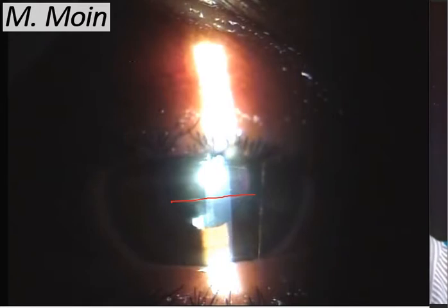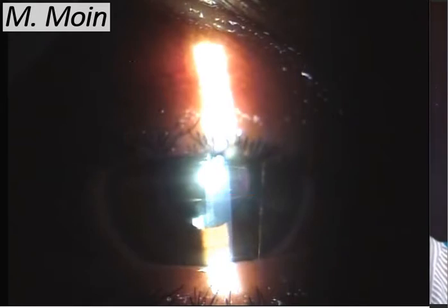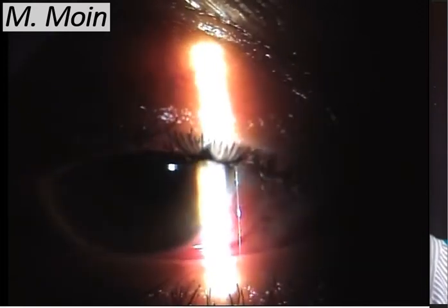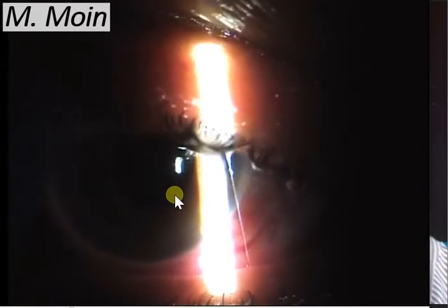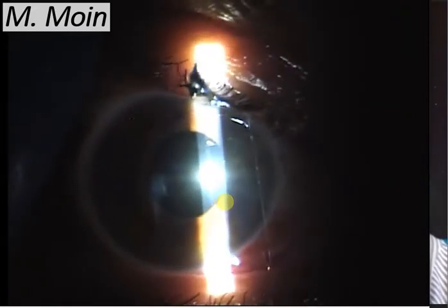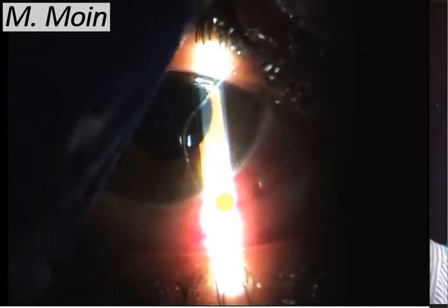You can see this gas bubble moving in the vitreous cavity. Then you put on your superfield lens — with gas you get a good red reflex. Put your lens on and try to see the gas bubble better.